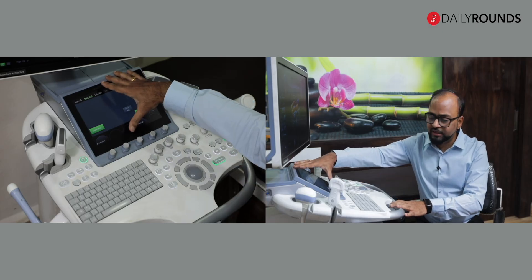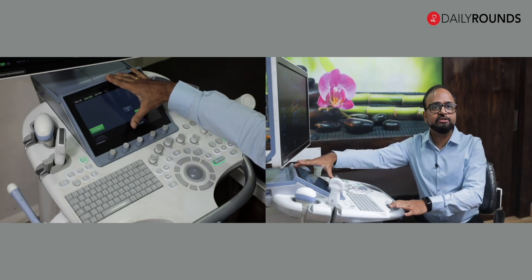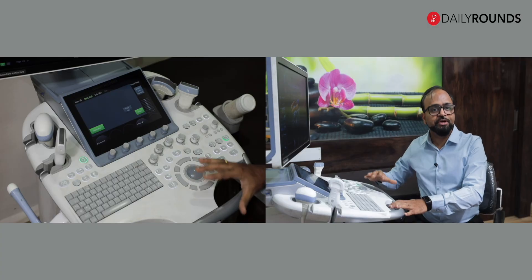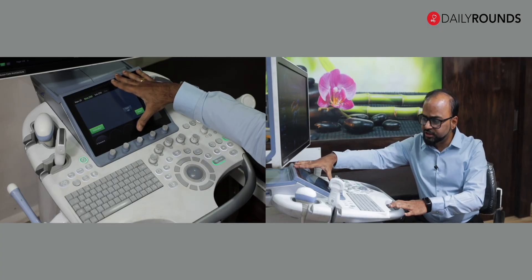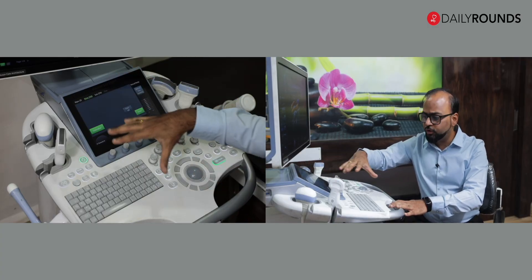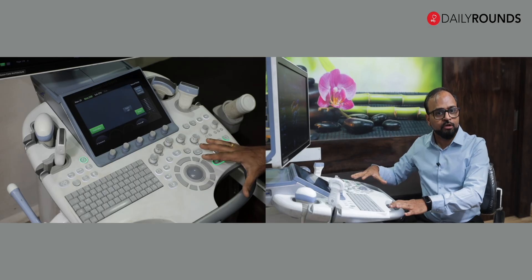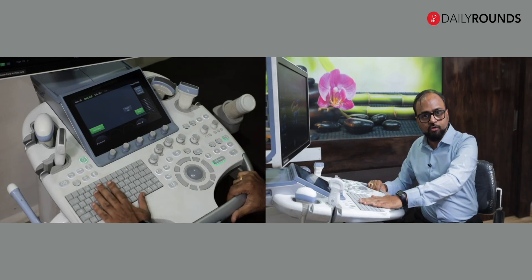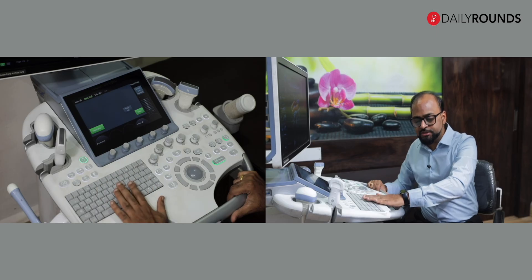Newer machines will have a touch screen display. Most older machines in the medium to intermediate range will not have this touch screen panel, but all the functionality will then be on the knobs or the console. You will have a standard keyboard here for patient data entry and labeling purposes.